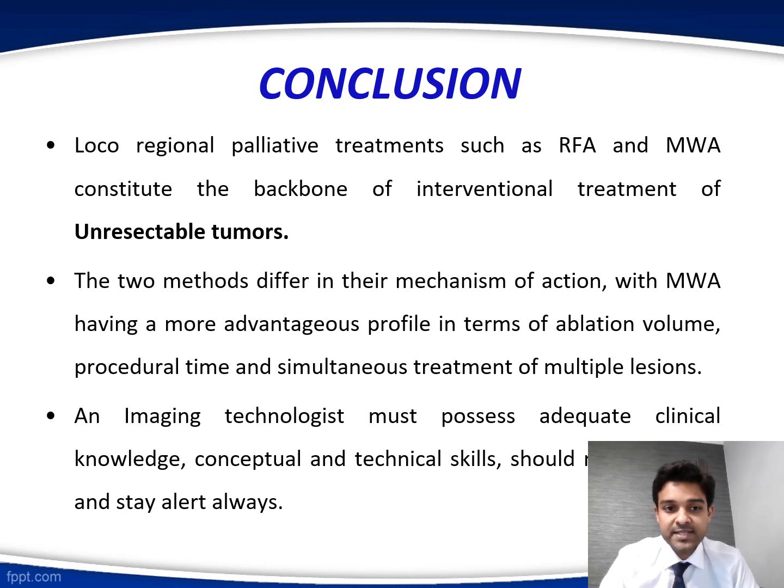Let me conclude by saying loco-regional palliative treatments such as RFA, microwave ablation, cryoablation, endometrial ablation, HIFU constitute the backbone of interventional treatment of unresectable tumors. The two methods, that is RFA and microwave, they differ in mechanisms of action, having microwave more advantageous profile in terms of ablation volume, procedural time, and simultaneous treatment of multiple lesions.